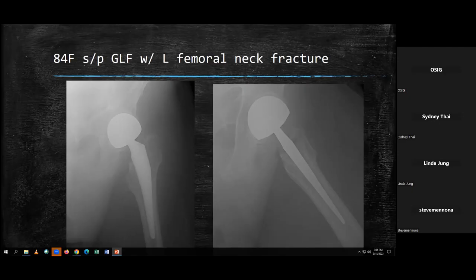And we'll call it subside. For patients, patients don't say, "Oh, my stem is subsiding," right? They say it hurts. They say it hurts when I try to start walking, start up pain. Usually, they get femoral or thigh pain, and you wait long enough, there'll be a catastrophic failure. It'll dislocate. It'll spin in the canal. But that's how that starts.